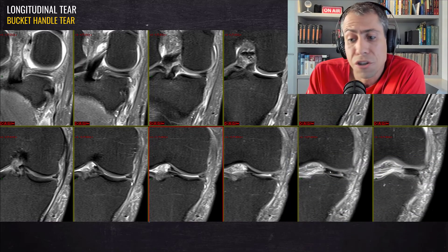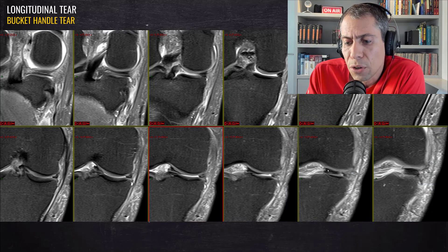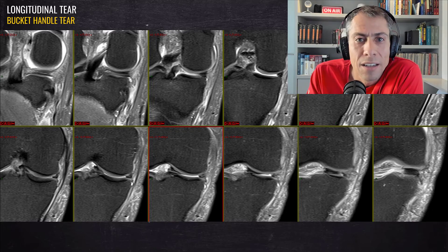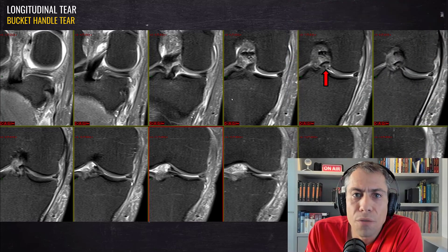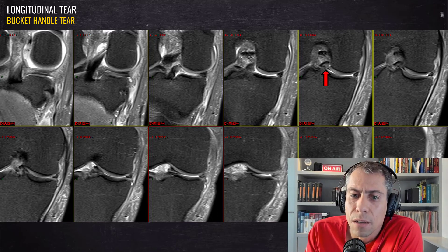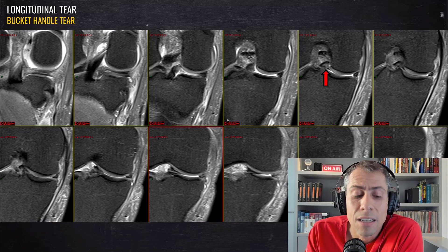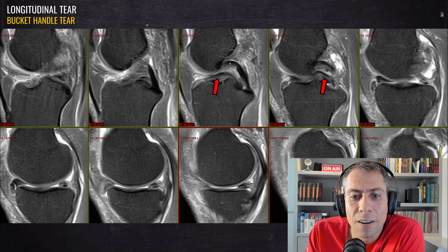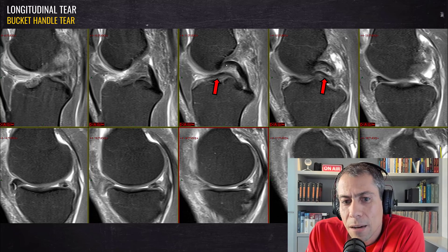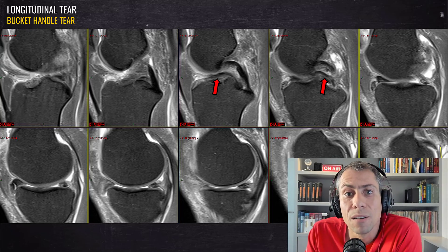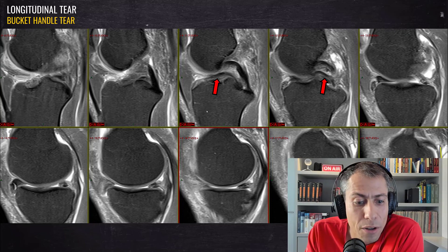Look here — the anterior cruciate ligament is torn in this case. As I mentioned, most of the time when you see a bucket handle tear, look for an ACL tear because most of the time it will be there. Here in the sagittal plane, we can see the bucket handle fragment parallel to the PCL — the posterior cruciate ligament — and that's the classic sign of a medial bucket handle tear: the double PCL sign. That's a beautiful case of the double PCL sign.